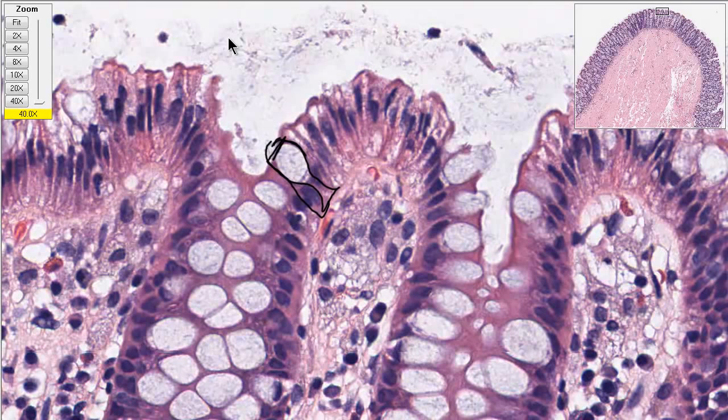That's released, and it forms this surface here, to let the stuff flow by. What the other cell does, in addition to letting things flow through, is absorb water. You don't want to release the 2 liters of fluid that you have around every one of your meals. You want to get a lot of that fluid back. That's the main use of the large intestine: absorbing the water, a consolidation process out of the stool.